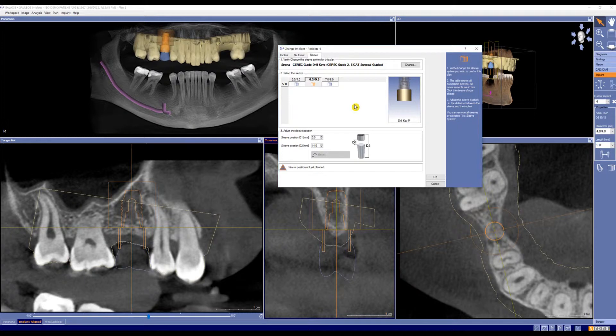Now for the sleeve, it's going to ask us for two vital pieces of information. The first is the diameter of sleeve we want to use. Notice on the implant that we've chosen, the diameter is 4.8 millimeters. The smaller sleeve has an interior diameter of 4.5 millimeters, so we cannot use that. The next smallest is the medium sized sleeve, which has an interior diameter of 5.3 millimeters — therefore our implant will fit into this sleeve, so that's the one we want to choose.